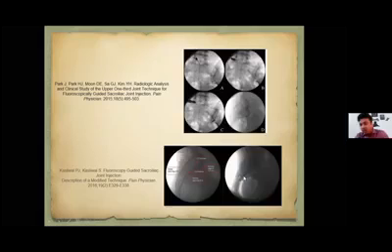When you do an arthrogram, when you inject the contrast, you will be able to see the sacroiliac joint quite visibly, and you're quite sure that it is inside. Although in the AP technique or the oblique technique also, there is contrast moving in the joint, with this technique you will be quite sure.